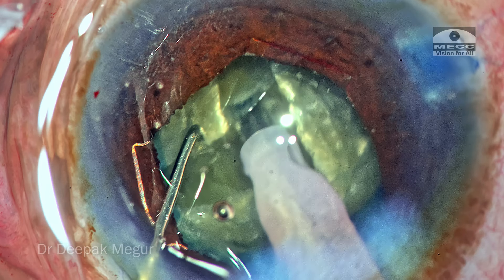Four grooves are created — slightly wider than ideal, but I am able to divide this dense nucleus into four smaller quadrants. Each fragment is then individually emulsified. There is notable corneal wound hydration occurring because of the longer corneal tunnel incision in this eye, which could have been avoided with a slightly smaller corneal entry. Nevertheless, nucleus emulsification is completed successfully.